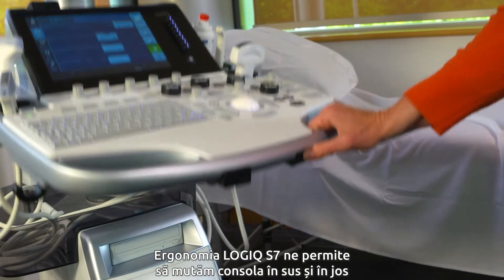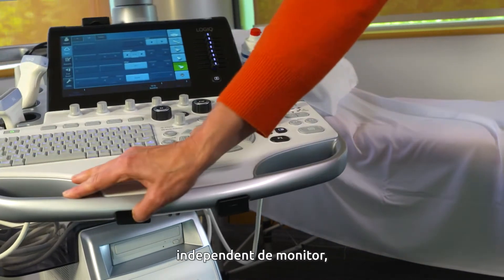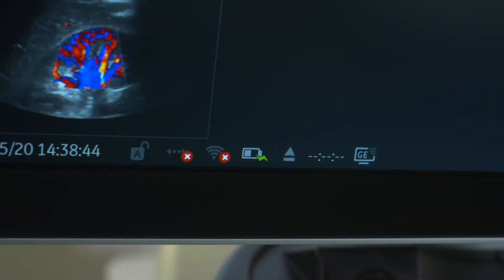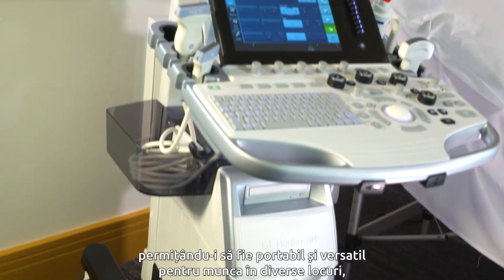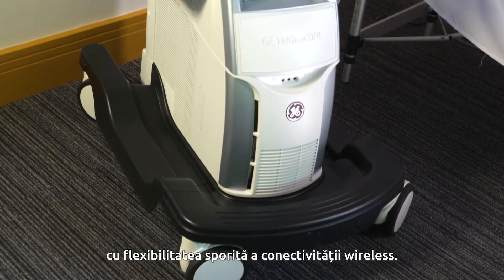The ergonomics of the LOGIQ S7 allows us to move the console up and down independent of the monitor, as well as moving the console left to right. With an extended battery we're able to scan for one hour offline, allowing it to be portable and versatile for ward work, with the increased flexibility of wireless connectivity.